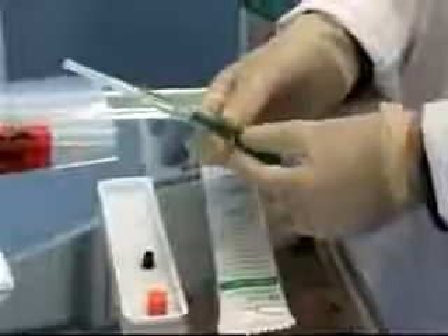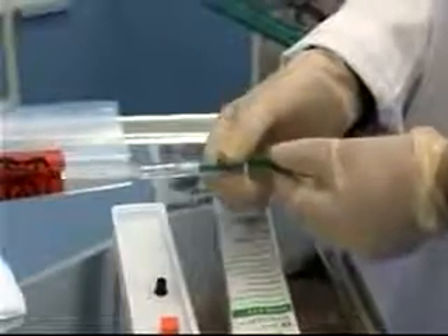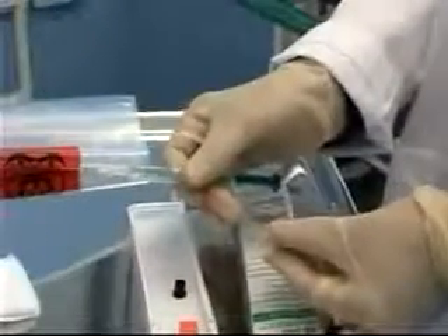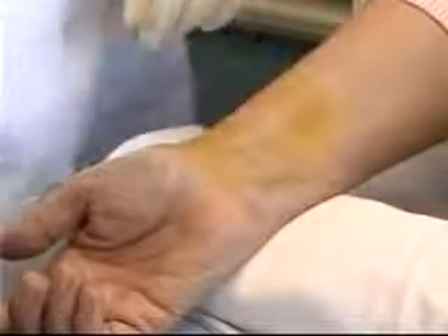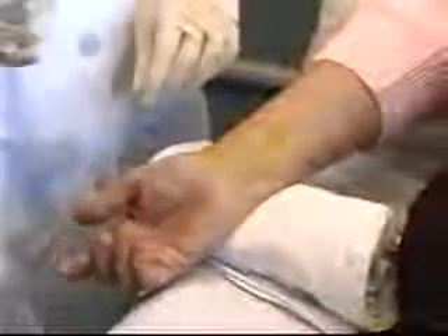I'm going to pull back slightly on the plunger so that once I've got the needle in the artery, it's going to be able to push back to fill the syringe with the pulsations from the artery. I'll slide the cap off my needle and make sure I can see the bevel so I know to go bevel-up when I insert the needle through the skin. I'm going to hold the syringe at a sharper angle, closer to 45 degrees, holding it much like a dart or a pen.